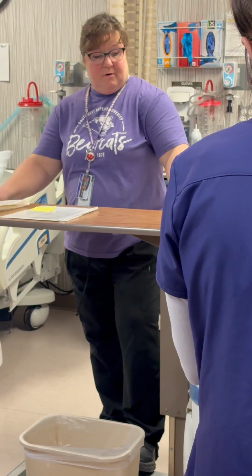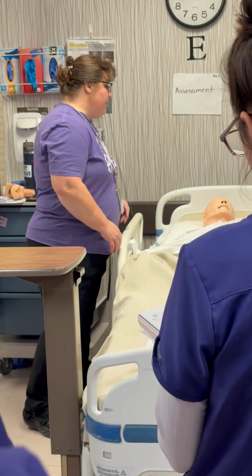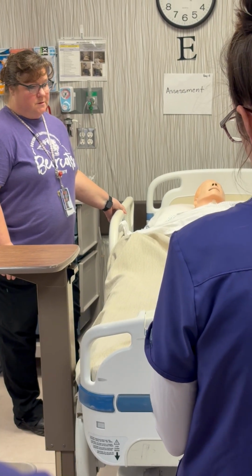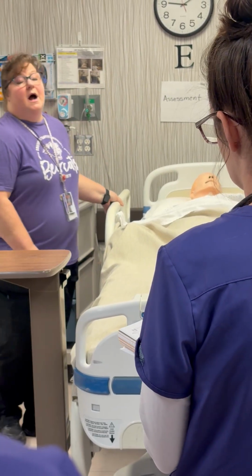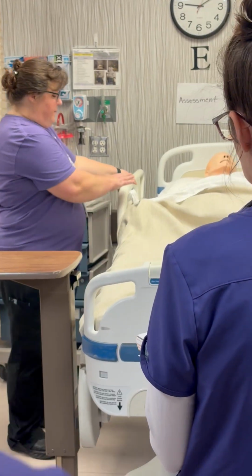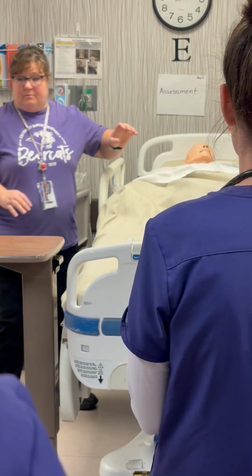let's start going down. So the first thing I'm gonna do, those 9 things, right? Are you allergic to any betadine, iodine, latex, shellfish, silver? No, okay. Make sure that my bed is at waist level. And you have 10 minutes to do this checkoff. I am not gonna make 10 minutes because I'm gonna be talking to you about this as we're doing it, okay? So waist is not from the bed rail, but to the bed, okay? So make sure that it's at waist level.